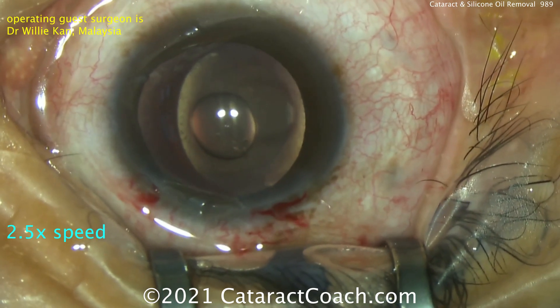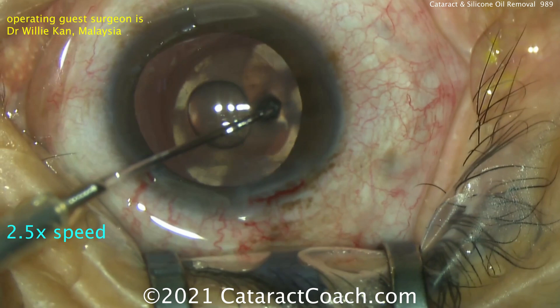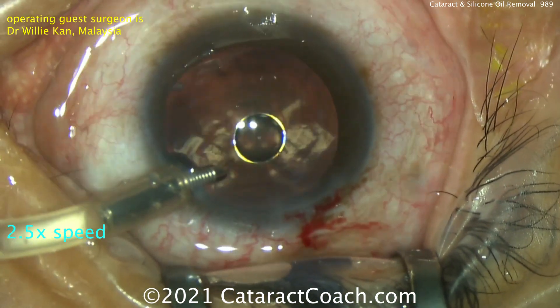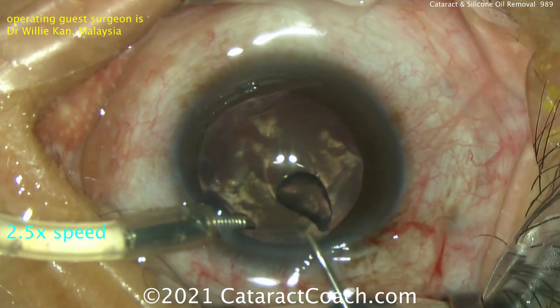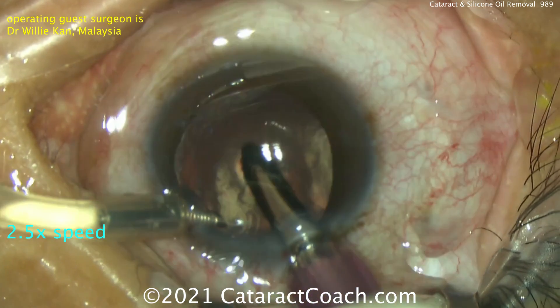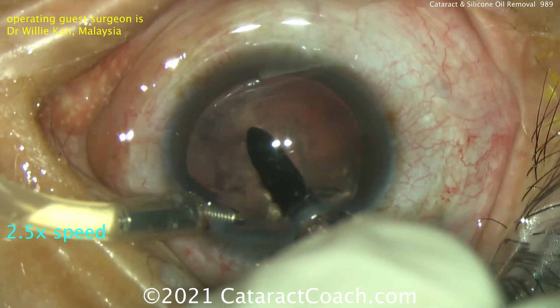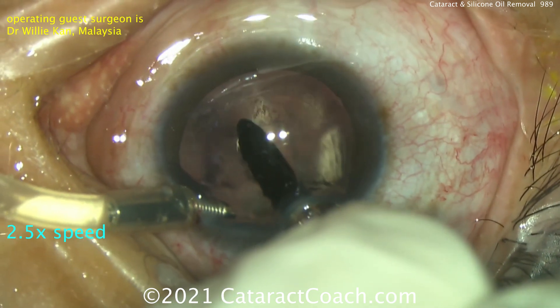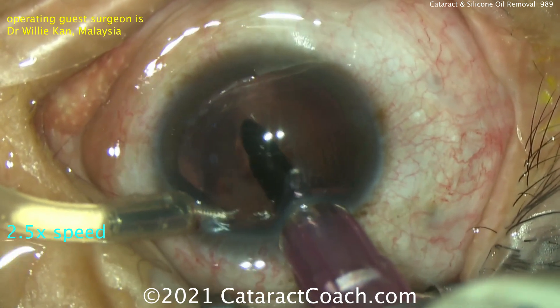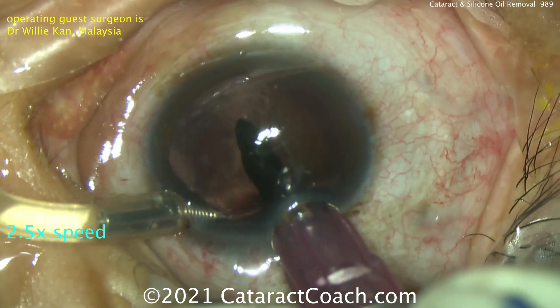Now it's time to remove the silicon oil. Remember, the oil has a very thick viscosity, so you want to have good infusion. An anterior chamber maintainer is placed in the eye for plenty of infusion. Set that infusion pressure high — or bottle height very high if you're using that. A larger bore aspiration needle goes inside. Go slowly and don't collapse the eye. Look at the difference in diameter of the two tubes: the suction one is much larger for the silicon oil, and the infusion one — the anterior chamber maintainer — is smaller.